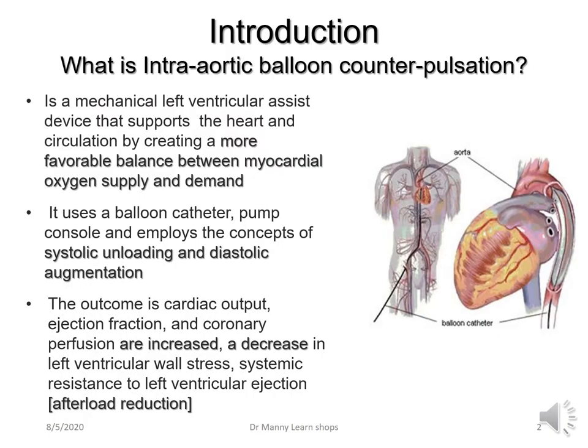What is intra-aortic balloon counterpulsation? Well, it's a mechanical left ventricular assist device. It supports the left ventricle. It supports the heart and circulation by creating a more favorable balance between myocardial oxygen supply and demand, which means it basically helps the heart function with less oxygen required.